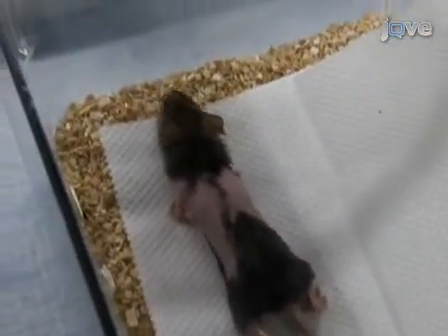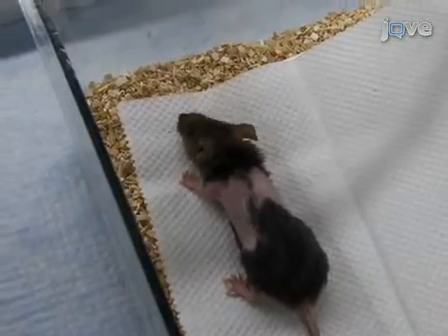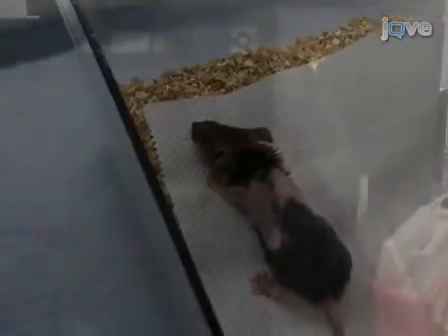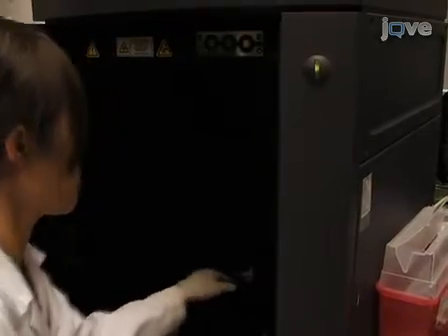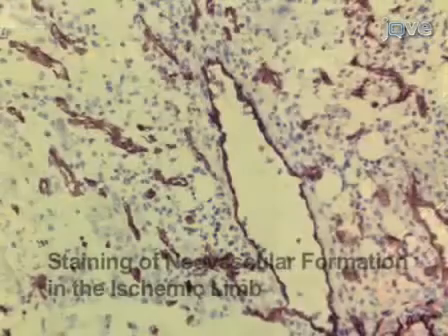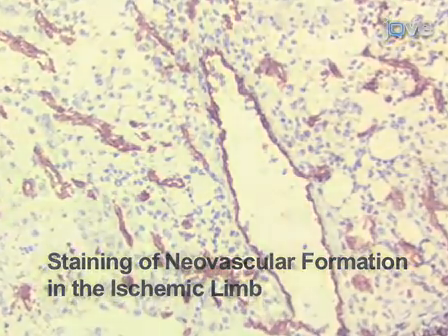Once all the data is acquired, return the animal to the recovery cage and monitor until the animal awakes. Repeat this procedure to track the cells over time. At a desired time point, the animal can be euthanized for assessment of tissue function.